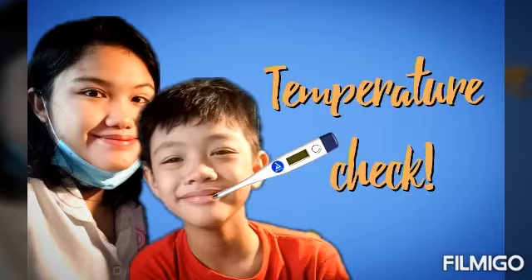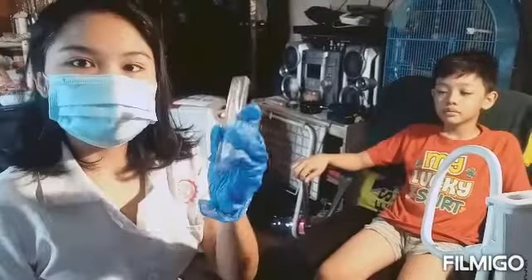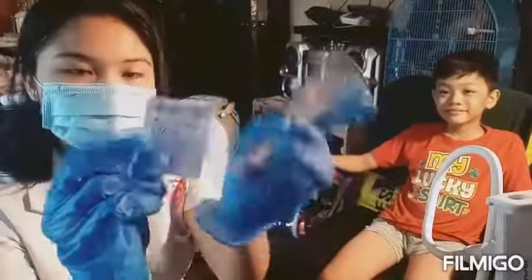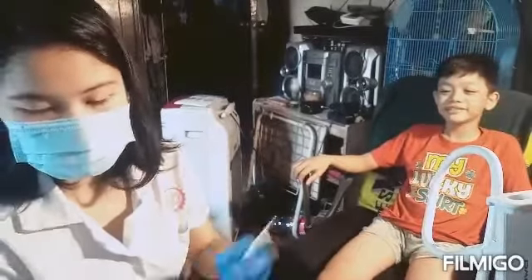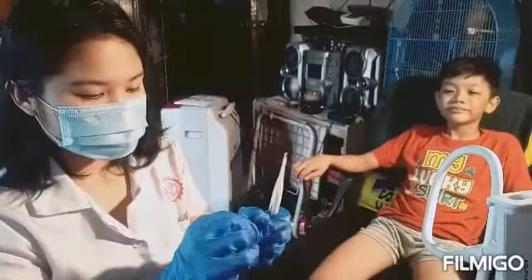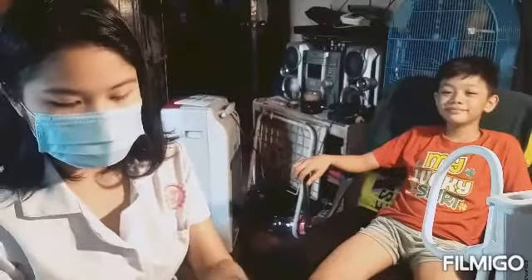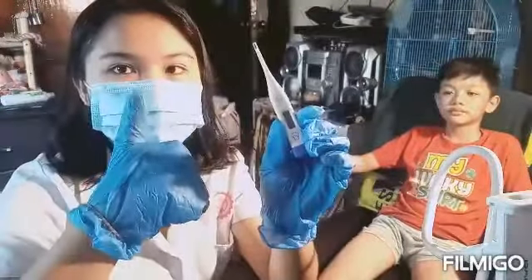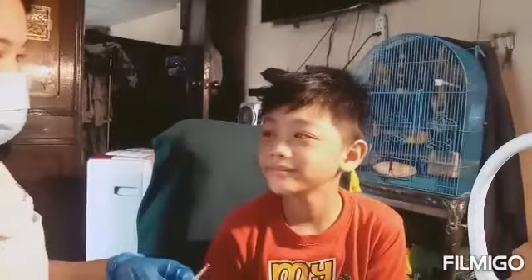Let's check Nathaniel's body temperature. We will be needing a digital thermometer and an alcohol swab to clean the digital thermometer. While cleaning the thermometer, let's talk about the 5 ways on how to take a body temperature. We have rectal, taken from a child's bottom; oral, taken under the mouth; axillary, in the armpit; tympanic, inside the ear; temporal artery, in the forehead. But today, we will do the oral method.